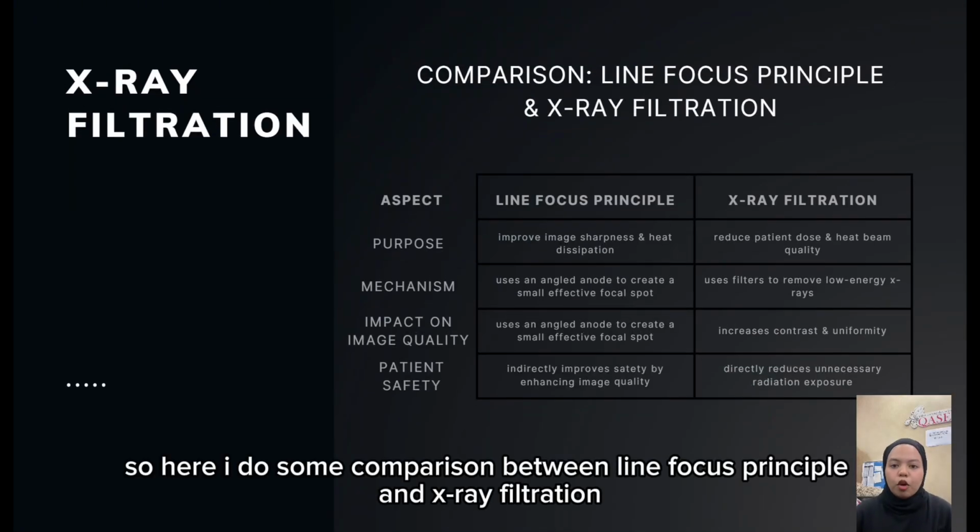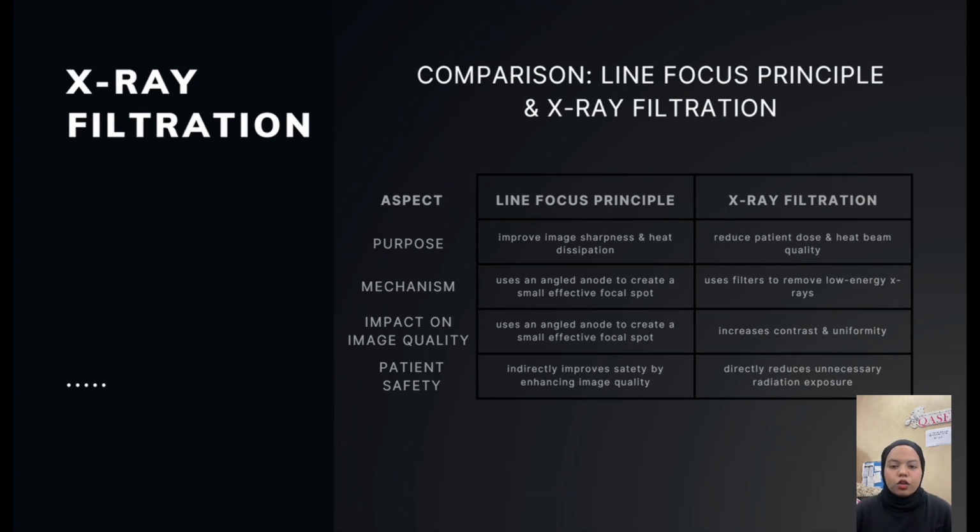So here I do some comparison between the line focus principle and X-ray filtration. The purpose of the line focus principle is to improve image sharpness and heat dissipation, while X-ray filtration is to reduce patient dose and improve the beam quality. For the mechanism, the line focus principle uses an angulated anode to create a small effective focus spot, and X-ray filtration uses filters to remove low energy X-rays.